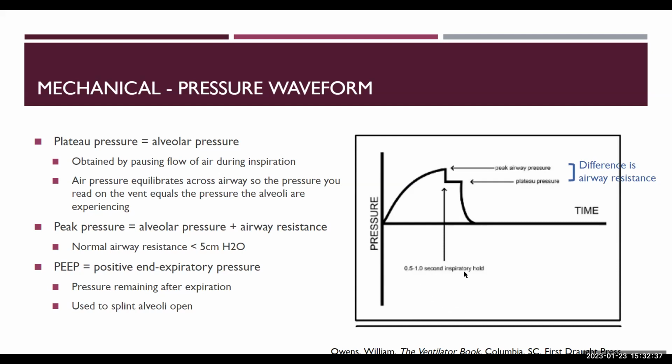So that's where this little arrow right here is talking about the inspiratory hold. So pausing the flow of air during inspiration. Once that breath goes into the patient, you pause the flow so that you can measure that plateau pressure.